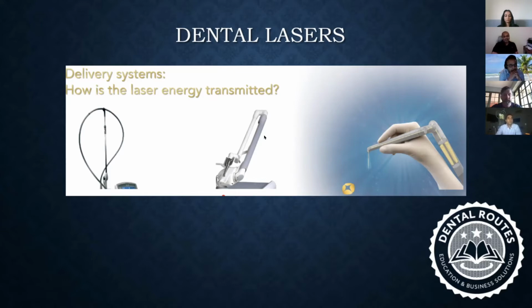But because of the length of the articulating arm, again, all it takes is some kind of a disturbance in the whole structure. Say if someone just accidentally tapped into it, or if it does go and bang into the wall, some kind of an accident can de-articulate the whole balance. And that's all that is needed for us to have a beam that is not properly focused, which means then we need to re-articulate the whole space. And do we have the necessary provision for it? If someone is going to come and sort it out next day morning, probably yes, but I doubt it. And that's why I started to get a bit worried there.